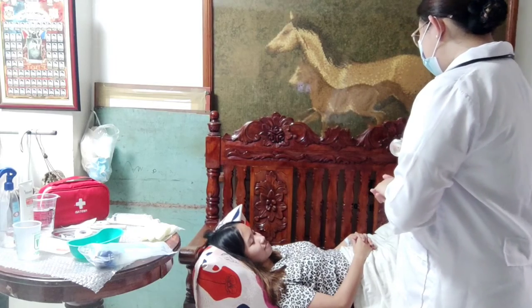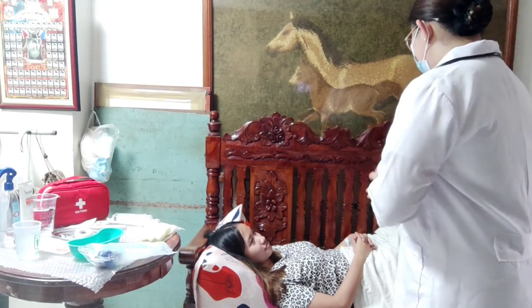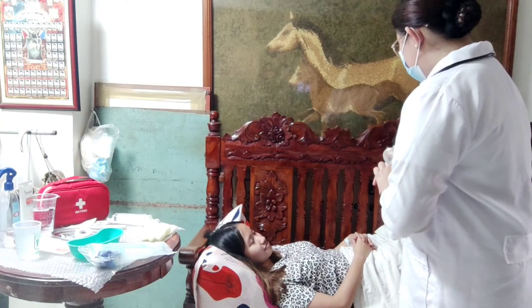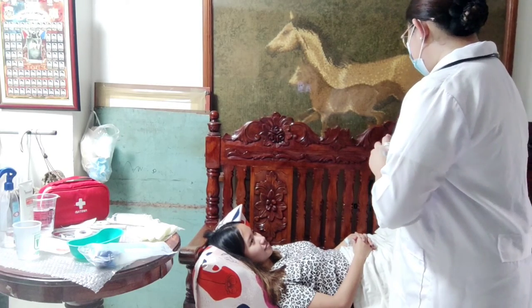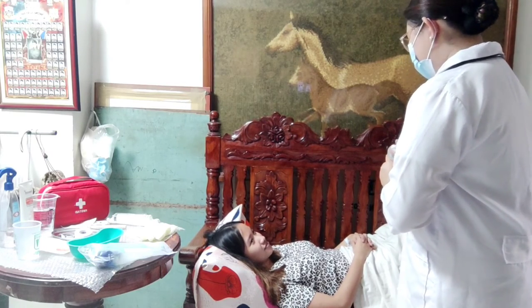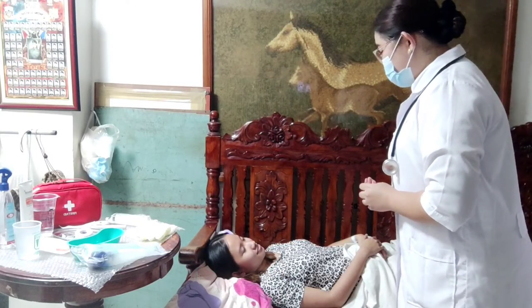Okay, Ma'am Caventa, I will explain the purpose and how it works. The NGT will be inserted through your nose down to your stomach. Then, the NGT will be used for feeding by giving you calories and nutrients. Also, we can administer medication and oral agents. Can I start now, Ma'am Caventa? You may start now. Okay, ma'am. Thank you. Ma'am Caventa, can I help you into the high Fowler's position?